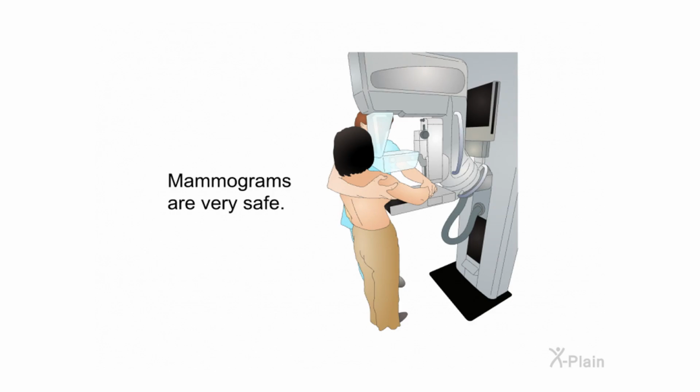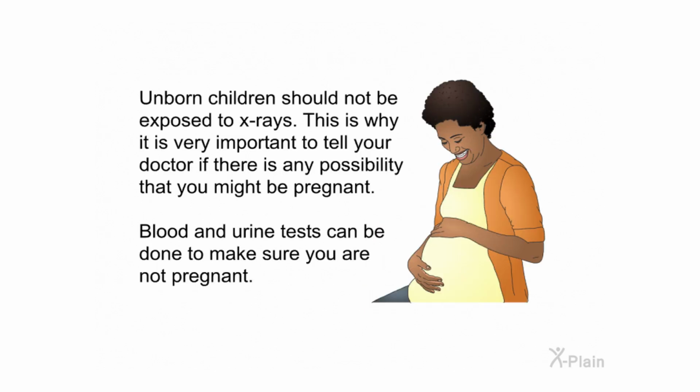Limitations. Mammograms are very safe. Unborn children should not be exposed to X-rays. This is why it is very important to tell your doctor if there is any possibility that you might be pregnant. Blood and urine tests can be done to make sure you are not pregnant.